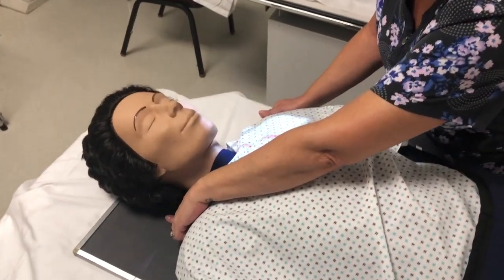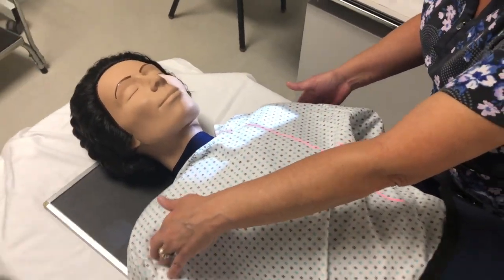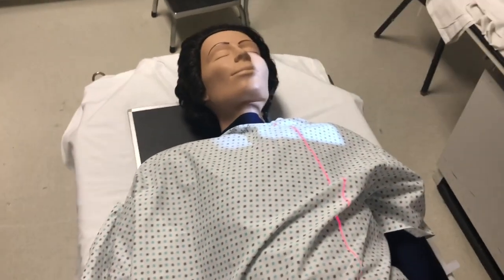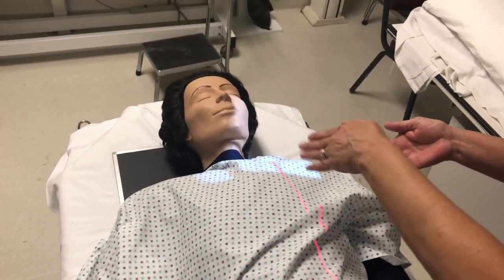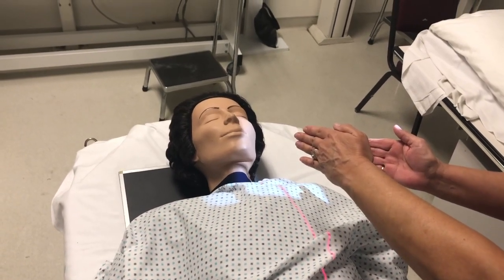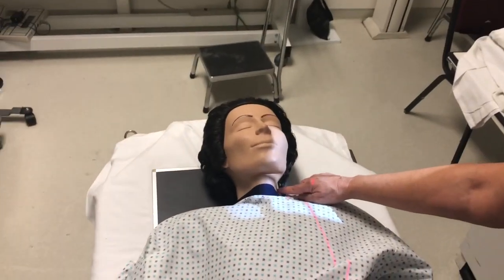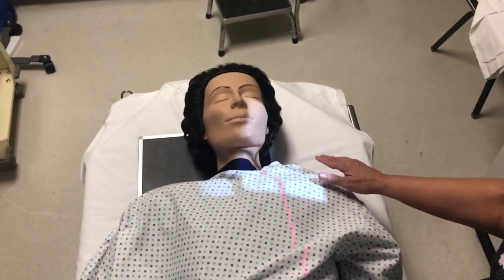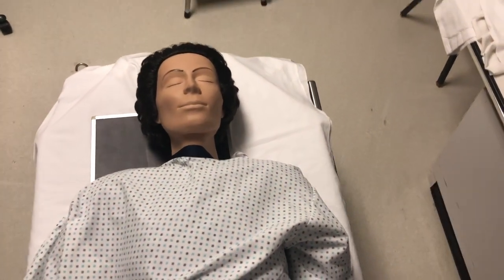This is my right marker. This is the equivalent of an RPO projection, and because the beam is passing 45 degrees lateral medially and 15 to 20 cephalic, I will in effect open up the intervertebral foramina. So this is how you would do a trauma cervical spine.